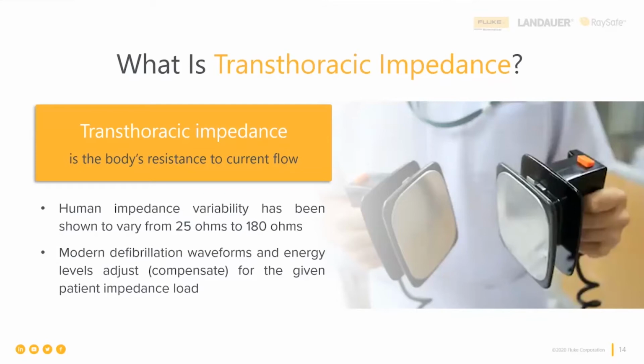That's right, it varies from person to person, but it also varies within the same person from a time during the day to another time during the day, because it's things like your skin resistance. It's things like how much muscle mass versus how much fat mass is in your body and your body conformation at the time. That may not change moment to moment, but it will change over time across months. So there are a lot of things. Are you older or are you younger? Things like that cause it to vary more than you think.